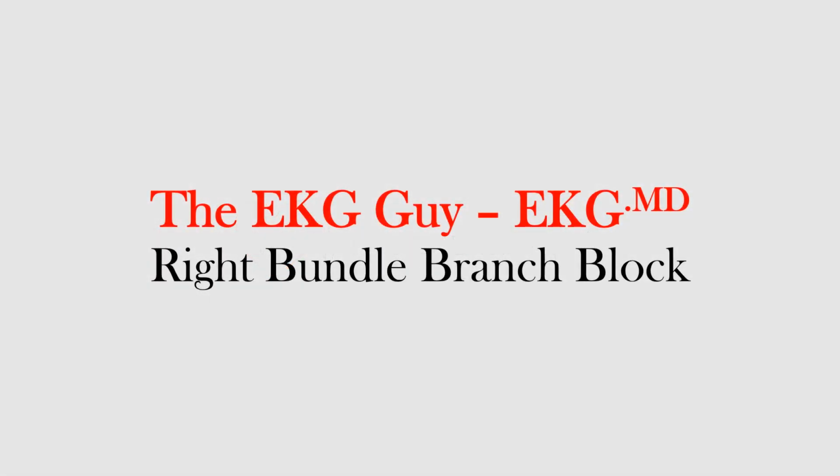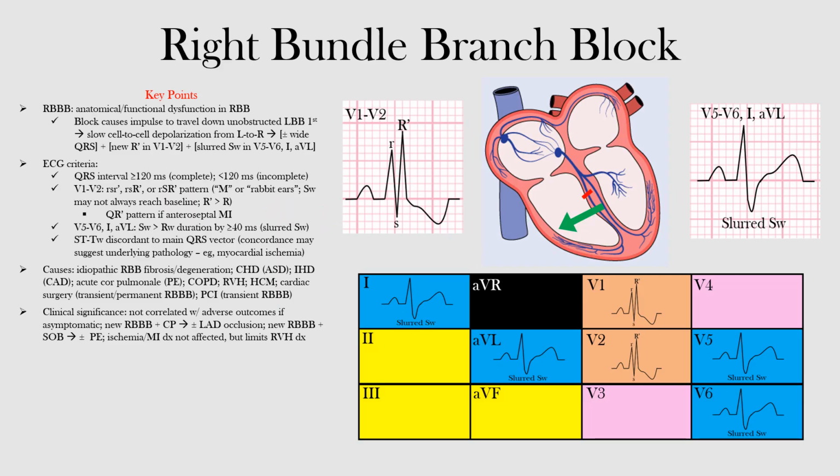In this lecture, we will discuss right bundle branch block, including its pathophysiology, EKG features, potential causes, and clinical significance. If you recall, the normal electrical conduction system of the heart starts at the SA node in the right atrium. Okay, so let's just review our conduction system.